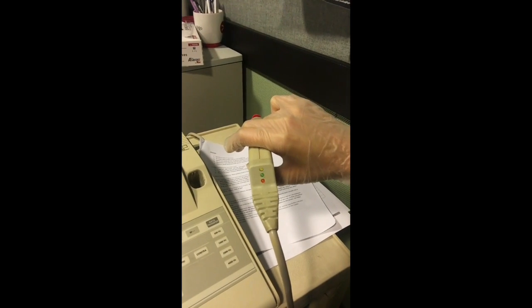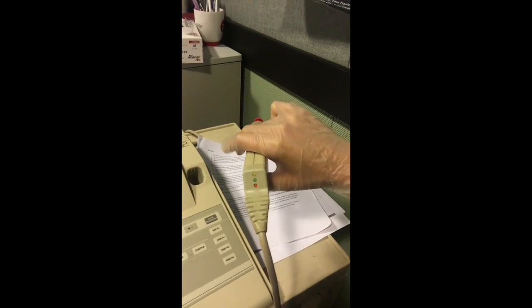As you can see, there's a blinking green light which means that it is ready for tympanometric testing. I'm going to insert it into Diana's right ear and make sure I'm maintaining a green light, which means that the ear canal is sealed off and the test is working properly.